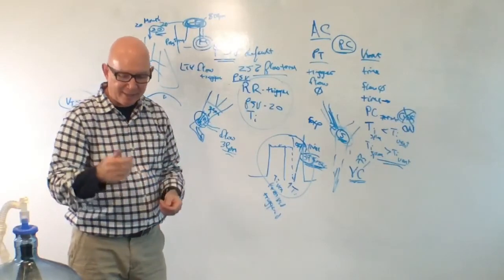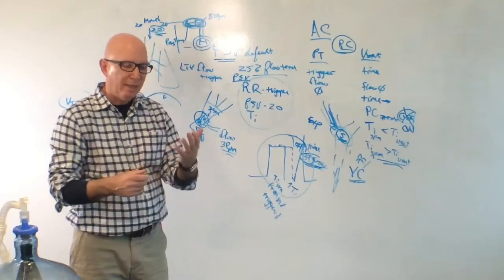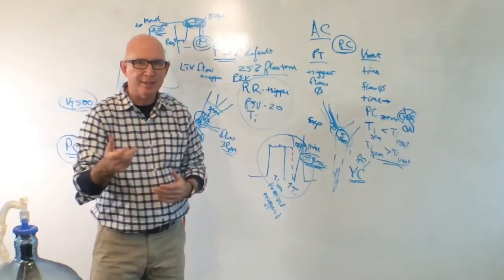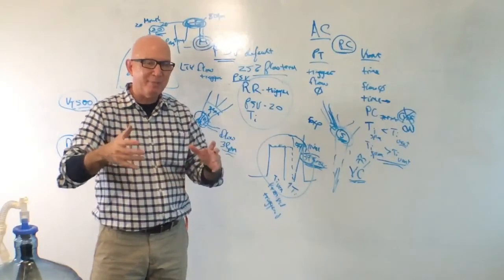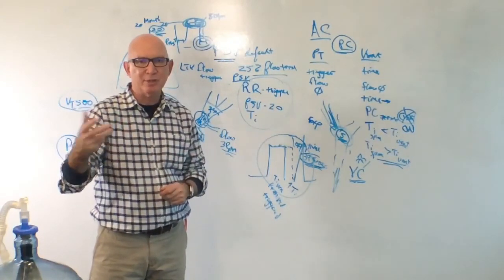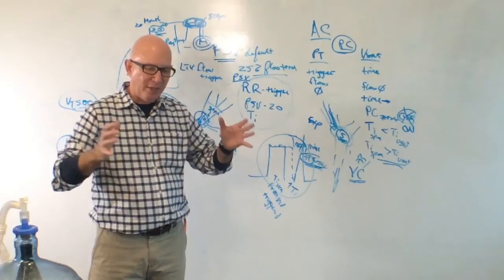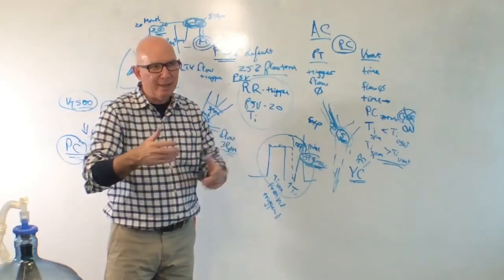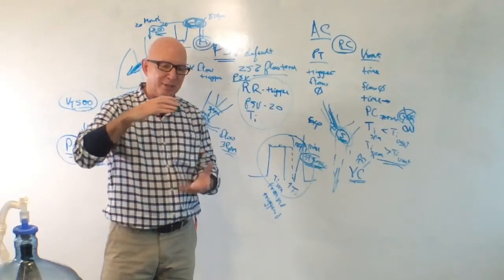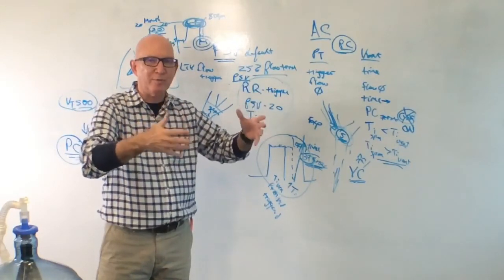Now, having said that, it reminds me that there was one question that asked about that particular case as well. People who have a heterogeneous lung disease, so you have regional differences in lung compliance, we typically have ventilated those patients with pressure control. And the thinking behind that is that we're not putting a constant volume in that's going to overstretch alveolar units that are more compliant. I guess on the other side of it, though, because you're generating the same kind of pressure, you're still going to get more volume change in those more compliant alveoli.